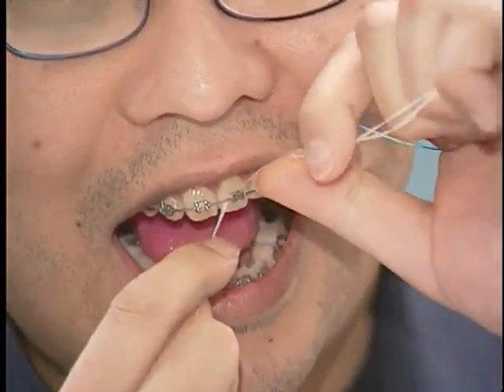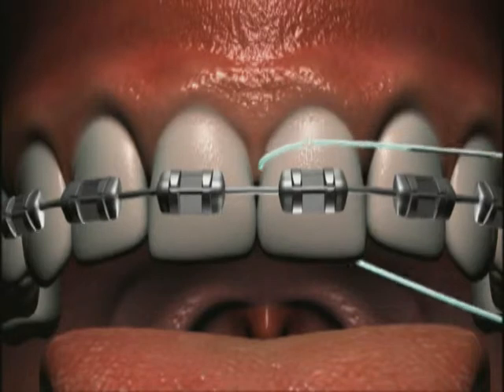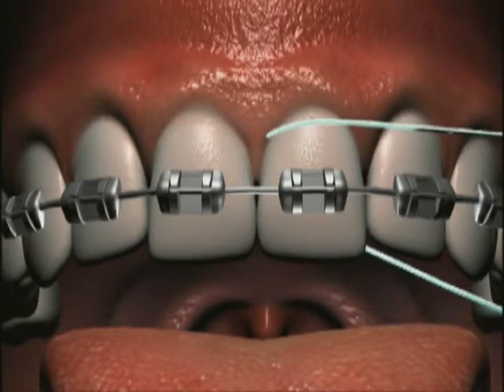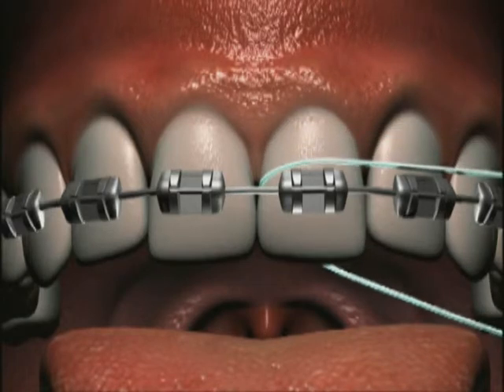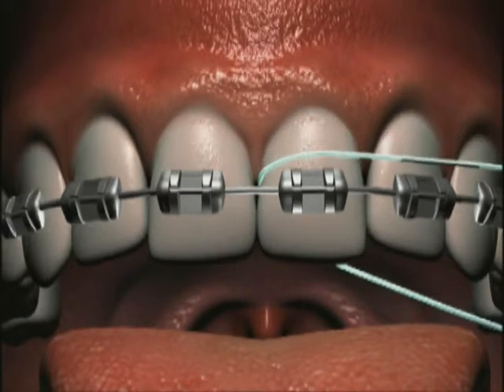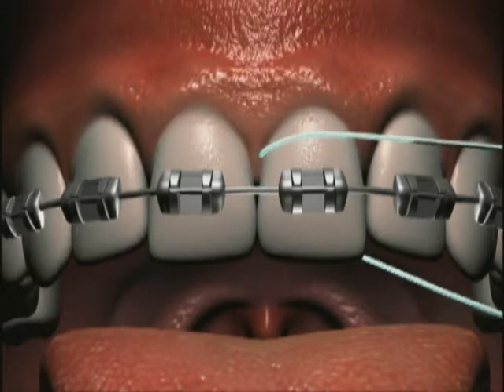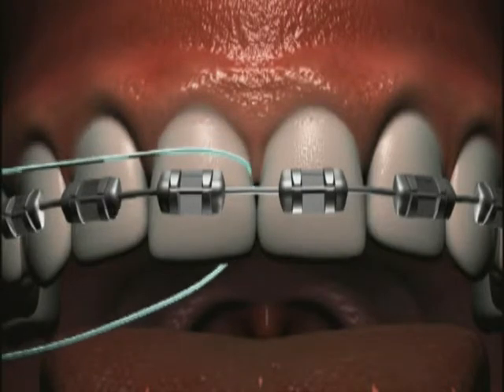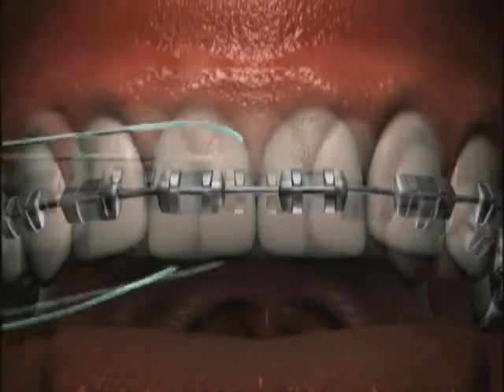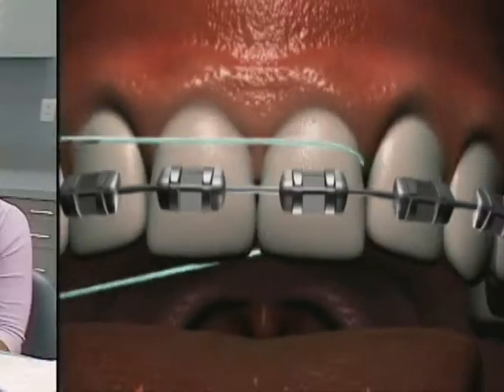With the floss in place, simply form a letter C around the tooth. Then slide the floss up under the gum and gently clean the side of each tooth with an up and down motion, easing the floss up under the gum line and pulling it back down toward the wire. Repeat this motion 4 or 5 times. After that, floss the neighboring tooth in the same way before pulling the floss out and using your threader to start again between the next 2 teeth.